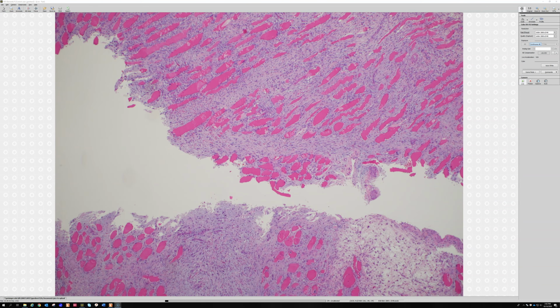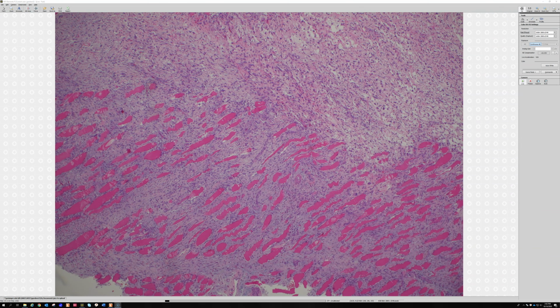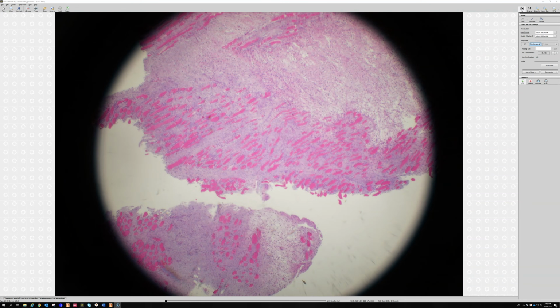And particularly in kids, when kids get proliferative fasciitis or proliferative myositis, it's the same thing. We just use a different name. If it's centered in the subcutis, we call it proliferative fasciitis. If it splays apart muscle like this, we say proliferative myositis. But in kids, there's a form that is very cellular and has a bunch of those ganglion-like cells, and that is pretty scary looking, for sure. Very scary looking. But this pattern from low power is so key.